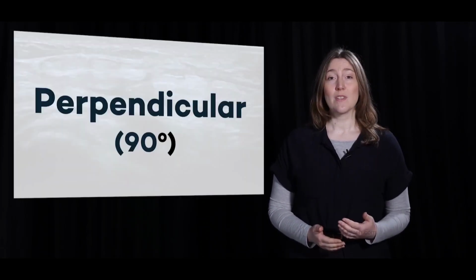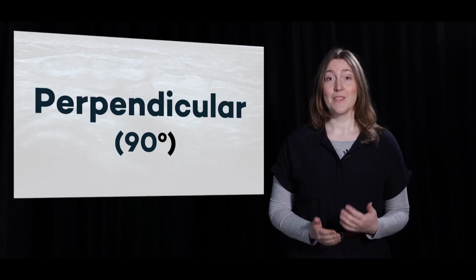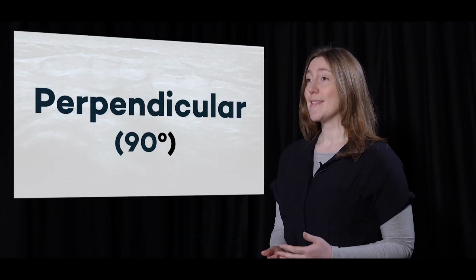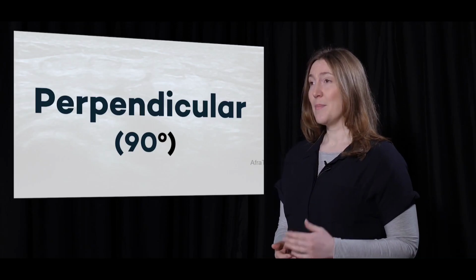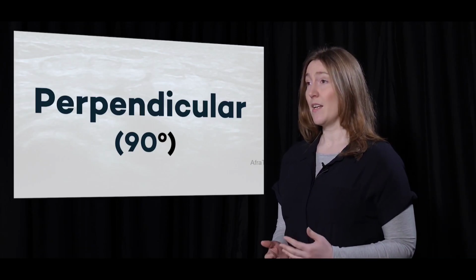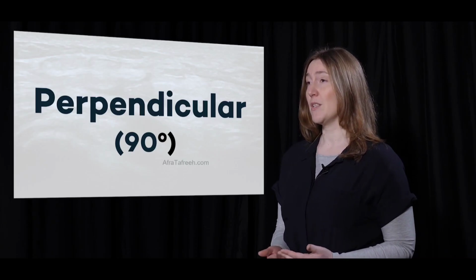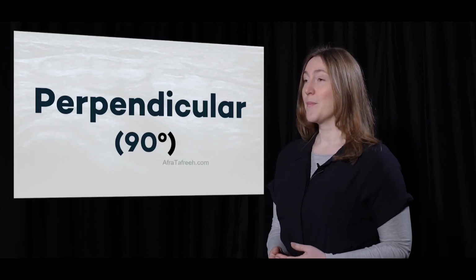This is the most important slide of the whole ultrasound, so pay attention now. Make sure you always scan all anatomical tissues, but especially tendons, perpendicularly, which means under a 90-degree angle on the fibre orientation. Let me explain why.